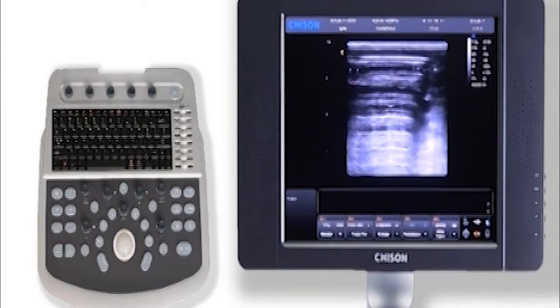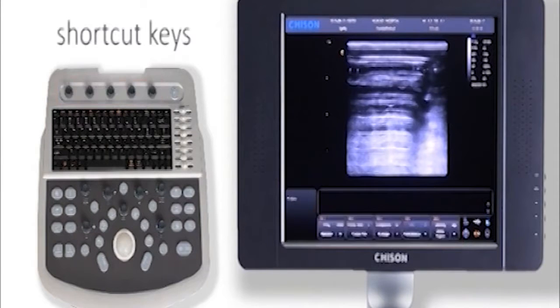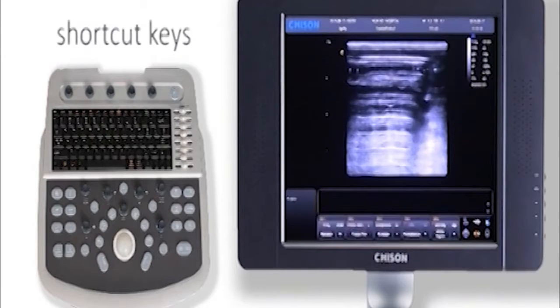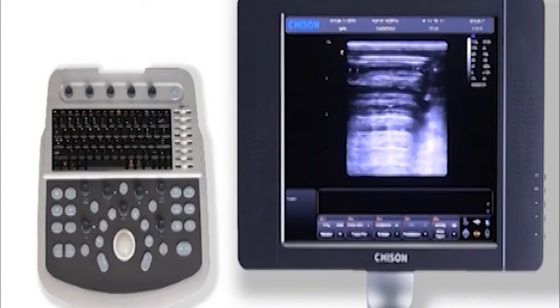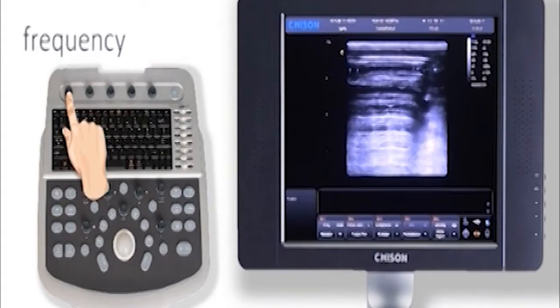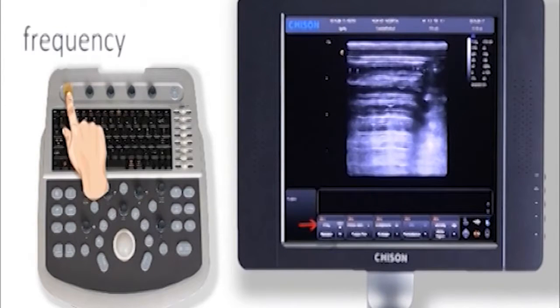There are some shortcut keys here. We have two line parameters. Press the first knob to adjust frequency according to different body size patients.